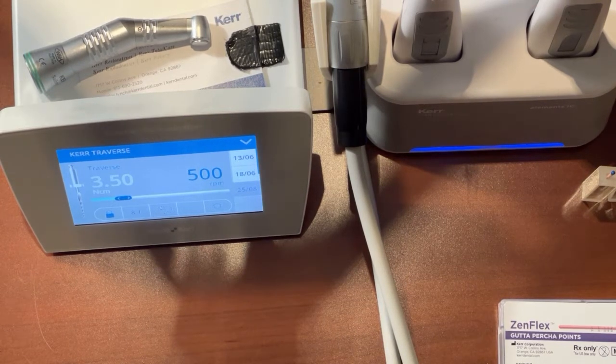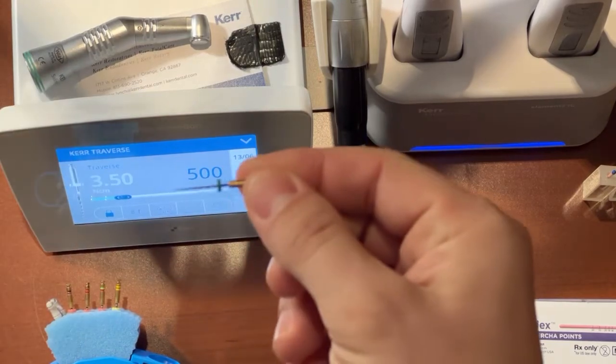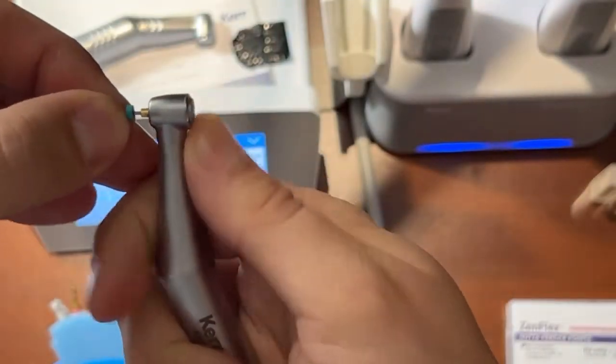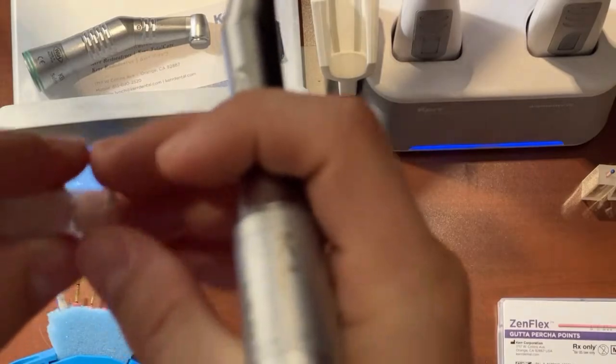So now I'm going to take out my Traverse Orifice Opener file right here, 2508 17 millimeter. Pop that into the chuck there. And then what I'll start to do is begin my shaping.